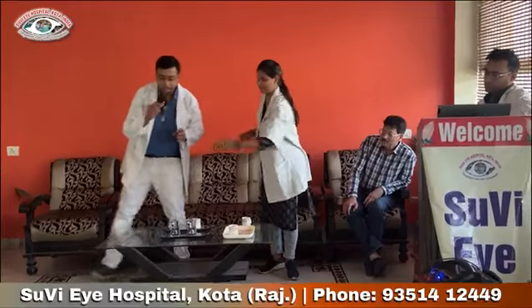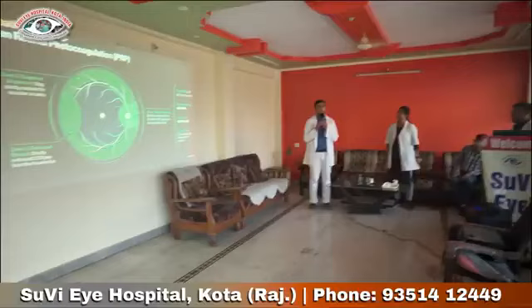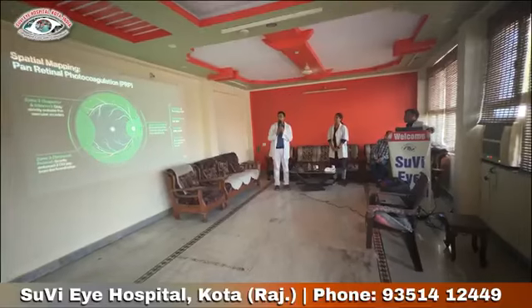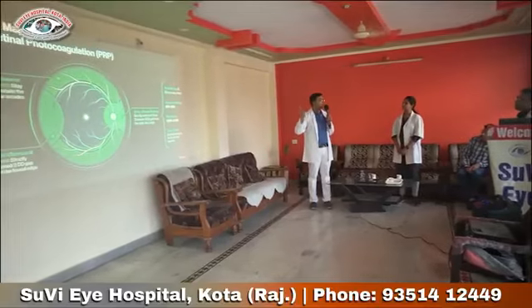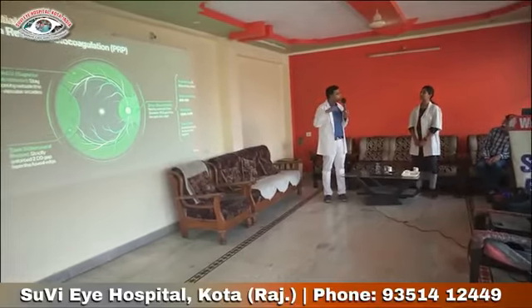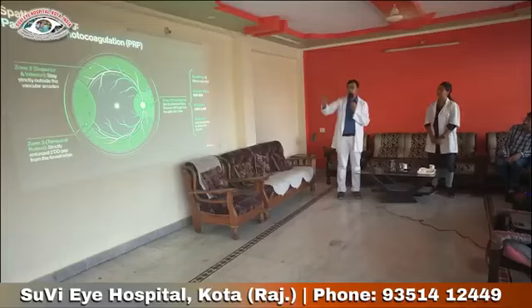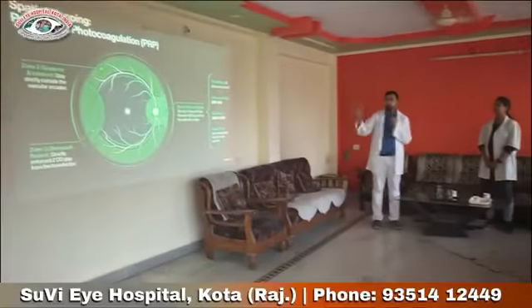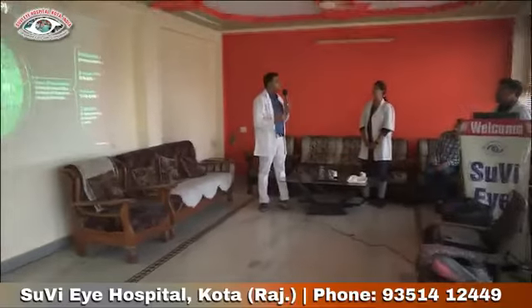Thank you. Very rightly you mentioned, but in cases of high creatinine and high RFT values, the reported side effect is exudative retinal detachment due to the retinal photocoagulation. What the literature says is we have to minimize the number of burns, 900 to 1000 burns per sitting, and you can increase the number of sittings in cases of high renal parameters. Exudative retinal detachment is one of the reported complications. It resolves on its own, but when it reaches the center, the patient will have a transient diminution of vision, so the patient gets apprehensive and anxious.